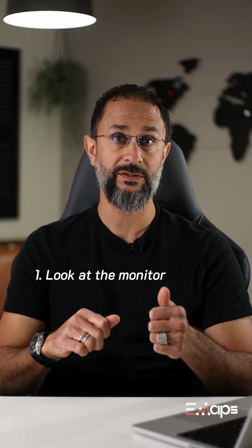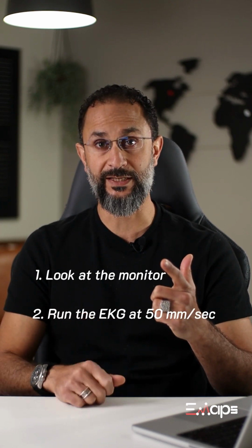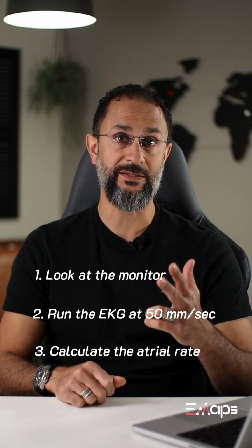So the bottom line is, when in doubt and confused whether you have sinus tachycardia versus atrial flutter, remember to go look at the monitor, run the EKG at 50 millimeters per second, and calculate the atrial rate and establish a correlation between it and the ventricular rate to figure out if this matches the AV block under consideration.